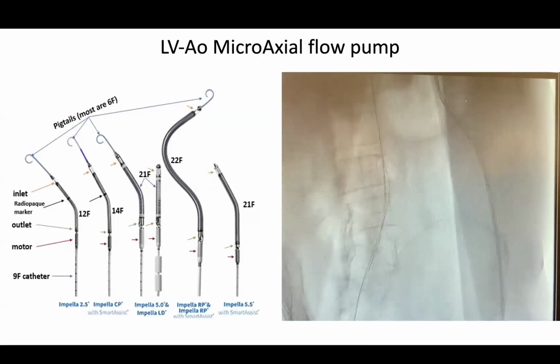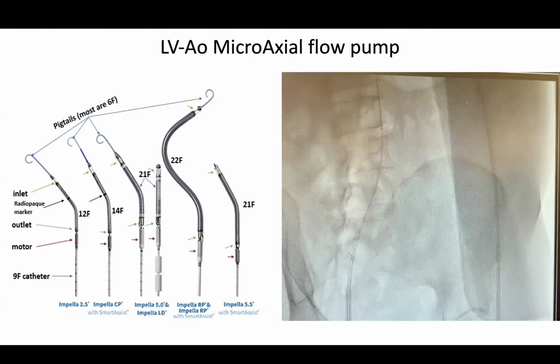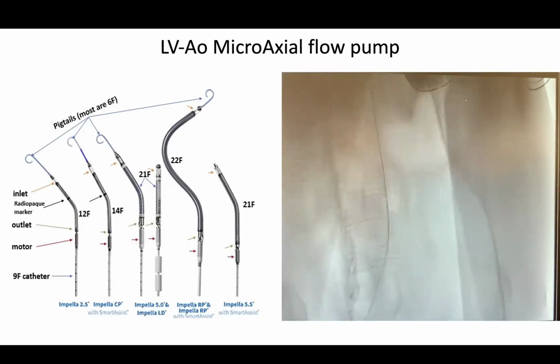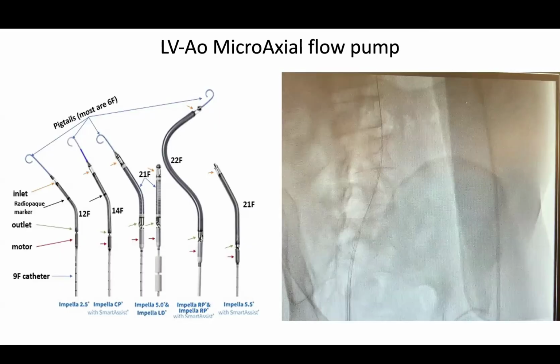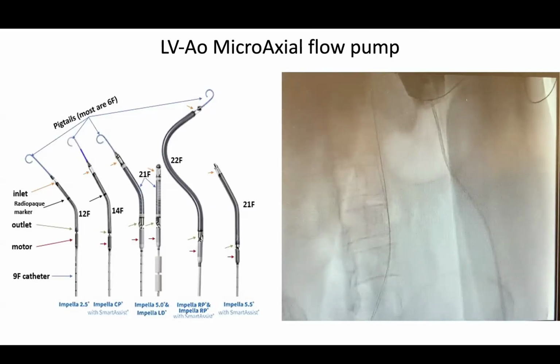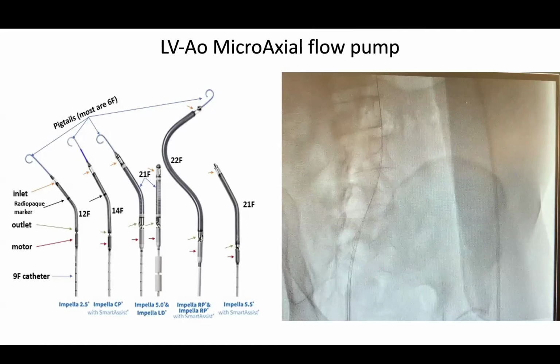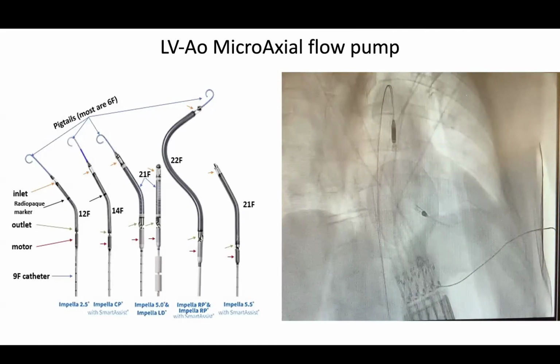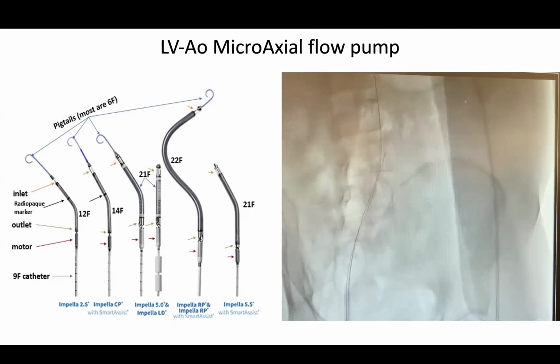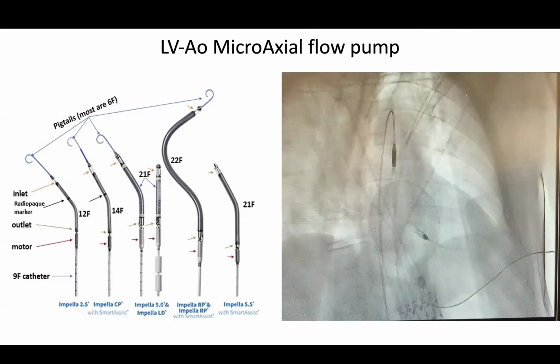All right, so why don't we talk a little bit about microaxial flow pumps, aka Impella devices for now. I mean, I was just in a meeting and they have 8 in EFS stages. So there'll be a lot of these things coming out, granted, if FDA has approved them. These are microaxial flow pumps. So they are a translation from LVAD medicine into percutaneous approaches.